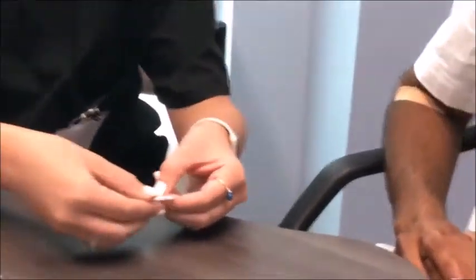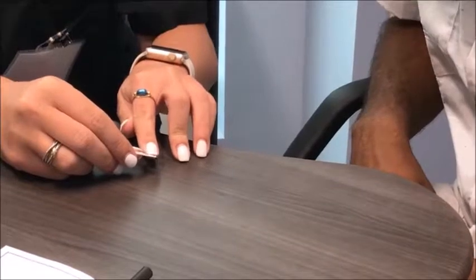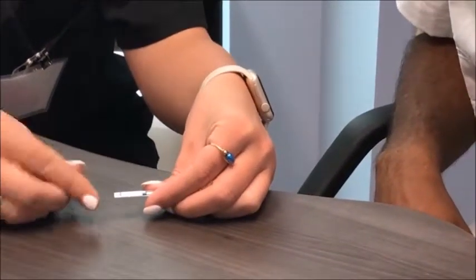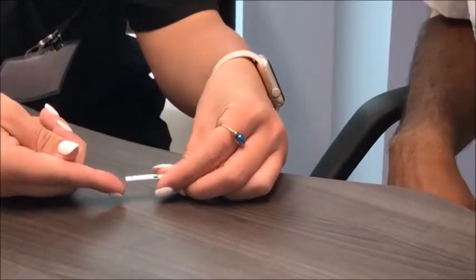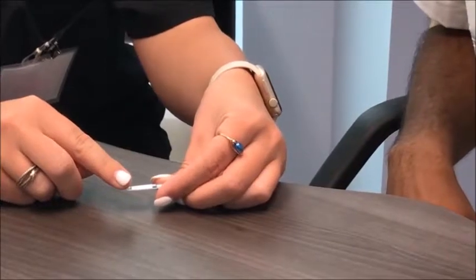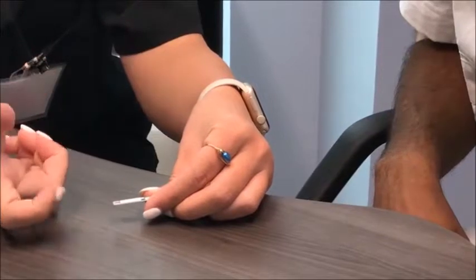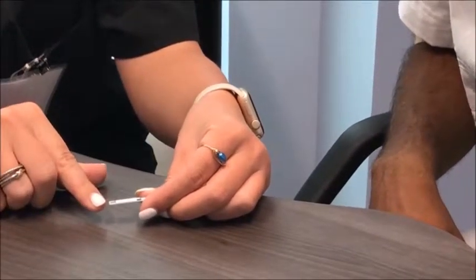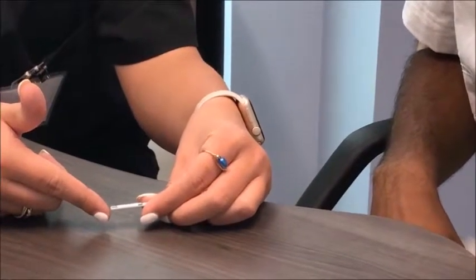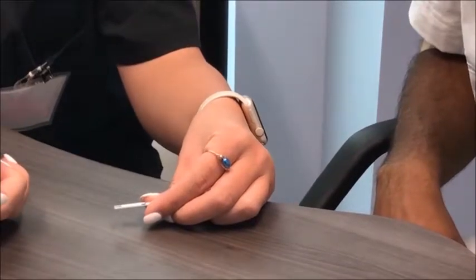I'm just going to show which part to stick in the glucometer and which part to collect the blood with. This is the part that you stick into the glucometer, and this is the part where you collect the blood from your finger. When collecting the blood, you don't want to go on top because that can give you a false high result. You want to go at a 90-degree angle, and it'll collect the blood like that. You don't want to oversaturate it, but most monitors should start counting down or give you a signal when you have enough blood, and you would remove your finger at that time.